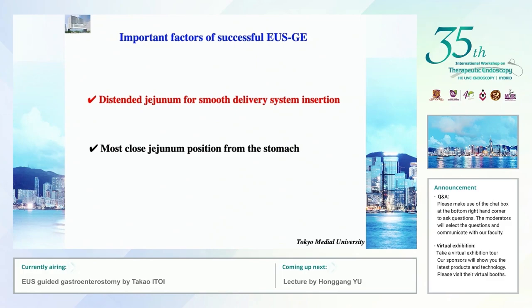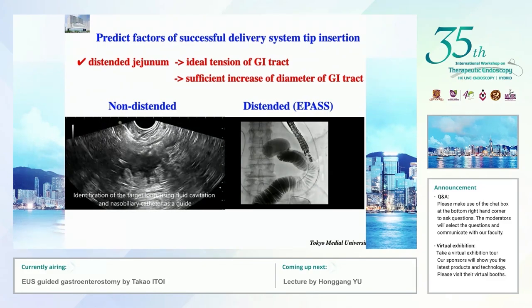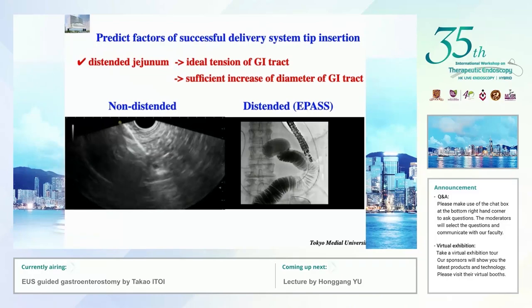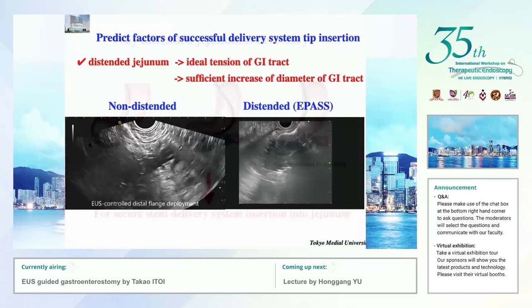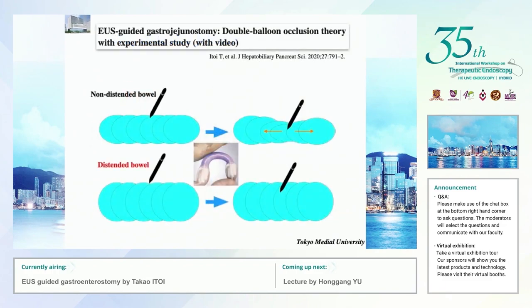In terms of the distended jejunum, a distended jejunum makes ideal tension of the GI tract and a sufficient increase of the diameter of the GI tract. In the case of a non-distended jejunum, the delivery system insertion looks not easy. However, with a distended jejunum, the delivery system insertion looks easy. Why do we need a distended jejunum? I think it is more preferable to advance a stent delivery system into the jejunum.